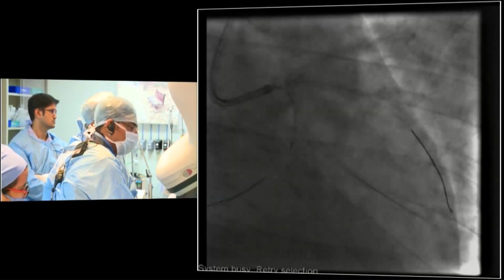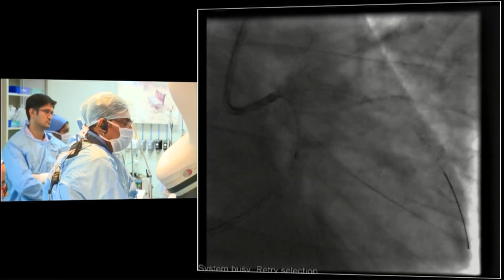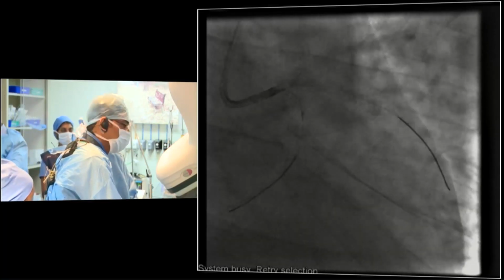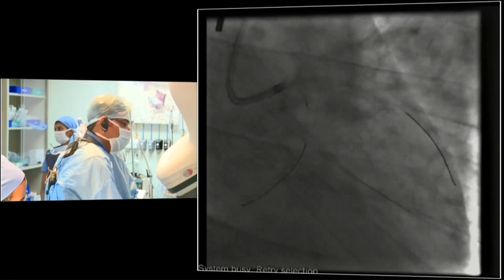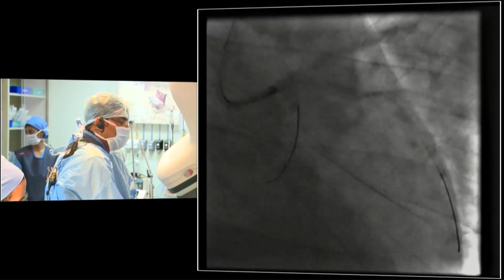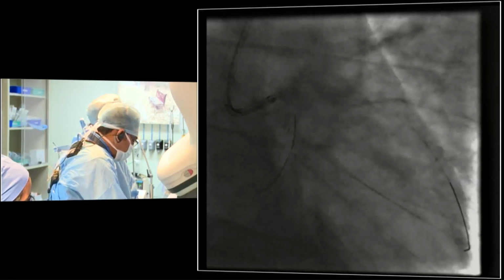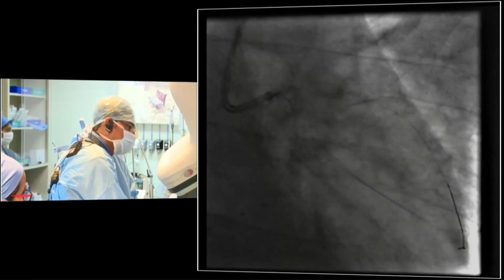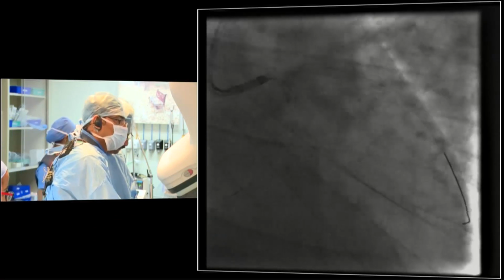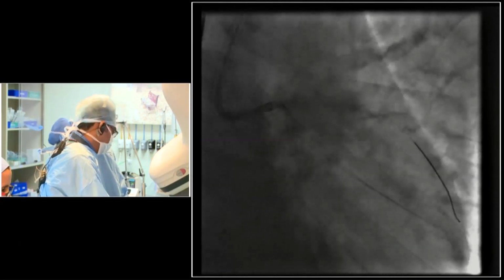Dr. Ajit, what is the tactile sensation of the balloon? Does it look very bulky? It is very bulky, there is no doubt. Even when you're pulling the balloon out, it looks a little difficult. Even to get the balloon out, I need two people to do that. So it's important that you don't pull the wire out in the bargain. Very tight inside. Now the plan is once we get this balloon out, we'll have a look at the IVUS and then have a look.